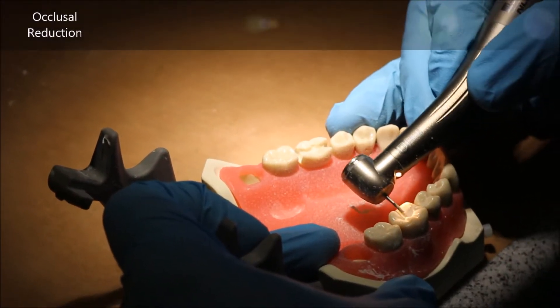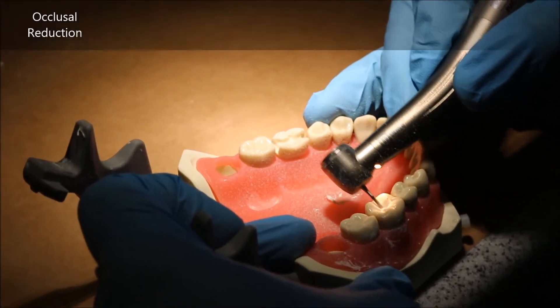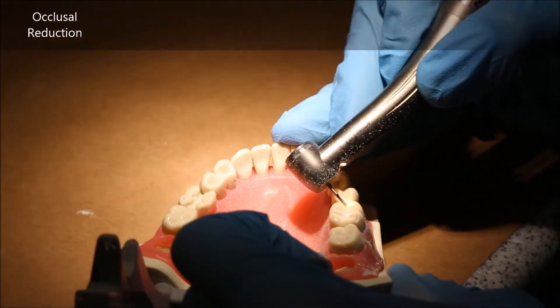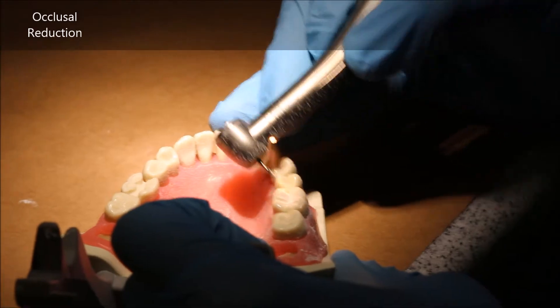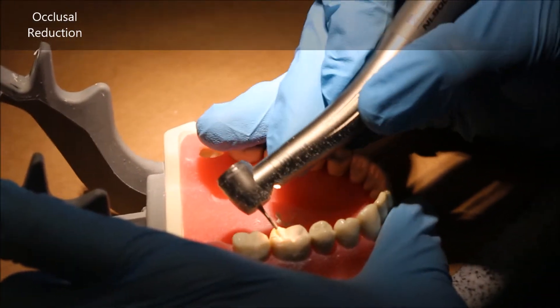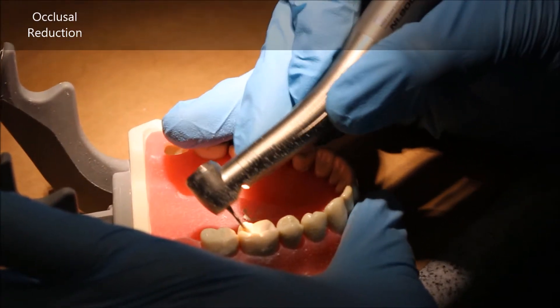Personally, I make them in the grooves, and that gives me enough of a marker to be able to take down the entire occlusal surface while maintaining the inclines of the cusps as they currently are, taking it all down by about one to one and a quarter millimeters.